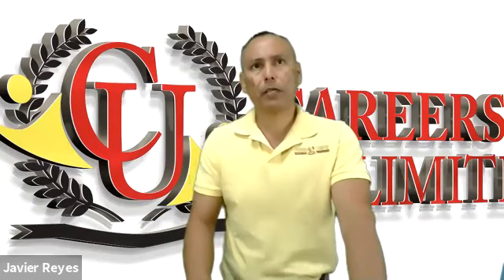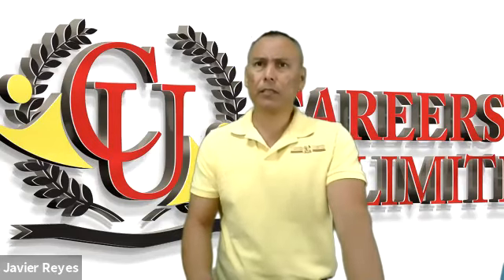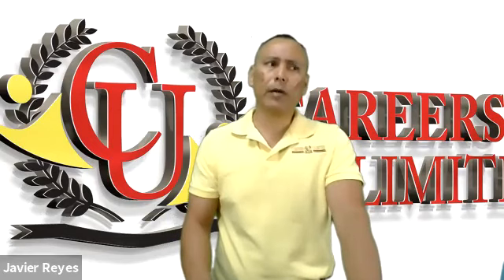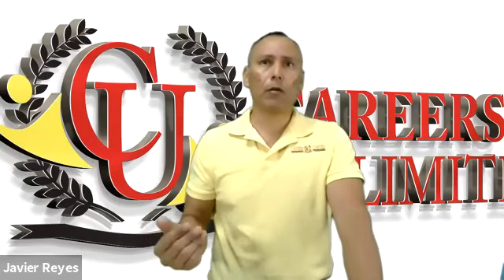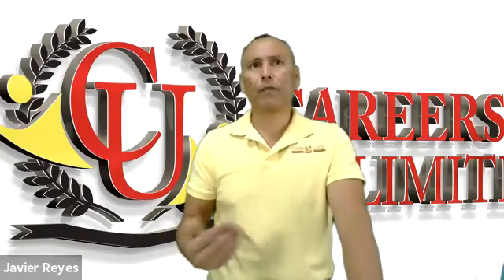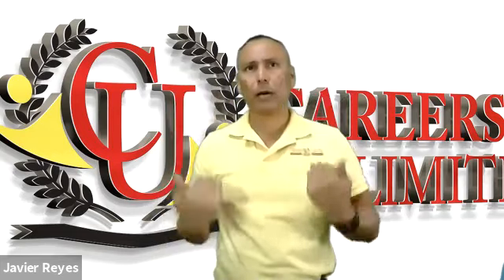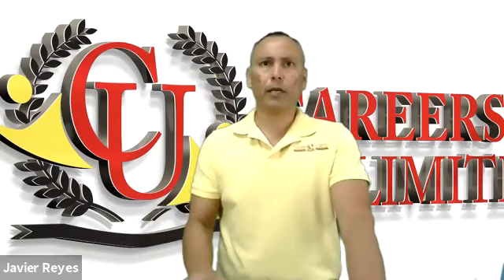Another possible complication that may occur during the procedure is fainting. Now, fainting doesn't occur often, but it can occur. So you always want to make sure that you ask a patient. Usually, I tell you to ask about history of fainting or history of fear of blood, fear of needles that may cause them to faint. Okay, fainting is a loss of consciousness, and usually their posture changes. Sometimes their blood pressure drops. Okay, so fainting is usually caused by insufficient blood flow to the brain, and that's the only reason.